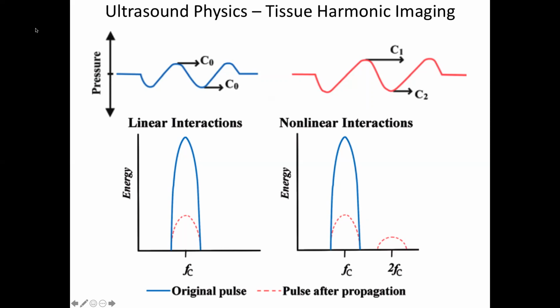So here's a sine wave that starts out from our transducer. We've created this vibration, and say it's moving through the liver, right? And it's, you know, pressure versus time.